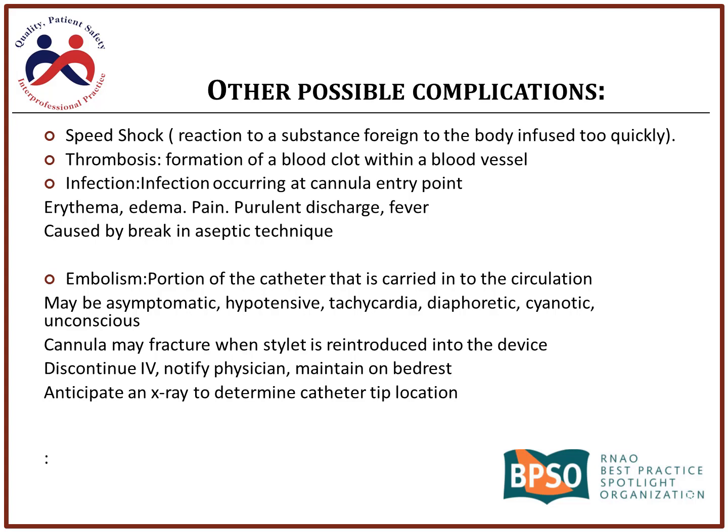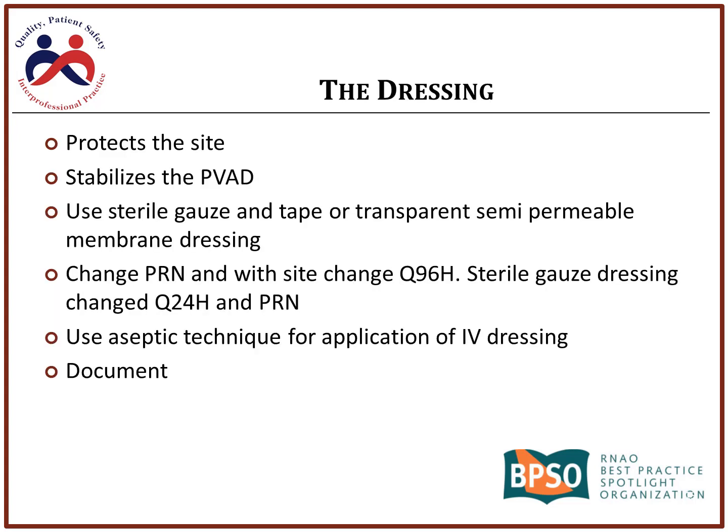One trick is we usually have the common white gloves on the floor. If you have difficulty with those, they have the blue nitrile gloves. They're a little bit harder to find, but they do allow for better palpation. They're a little more tactile, and it's far better than not wearing gloves. The dressing site, so basically what it does is protect your IV.